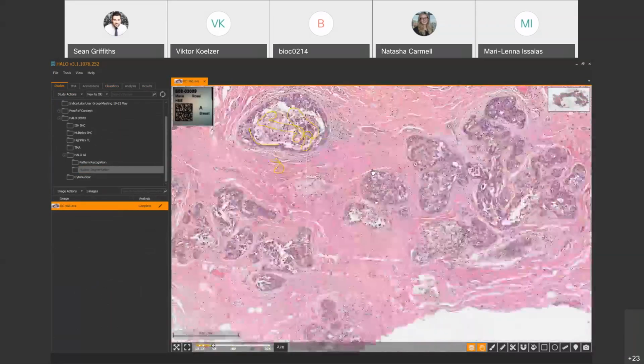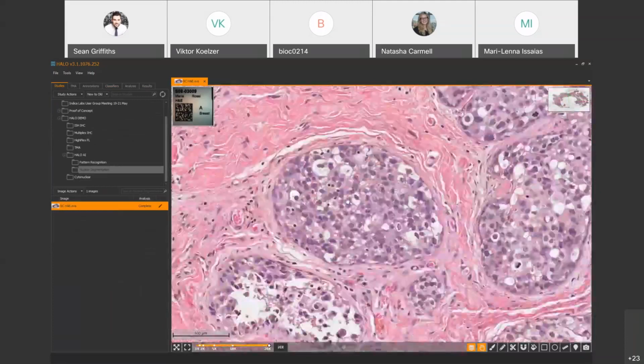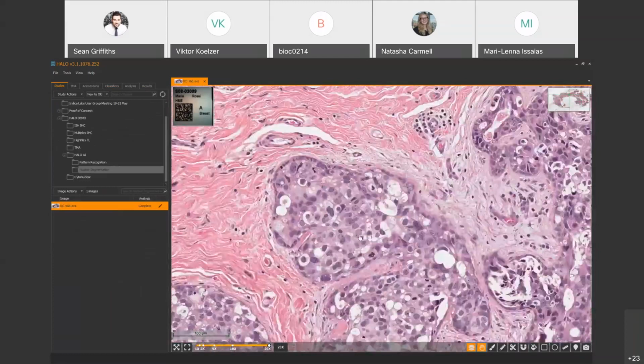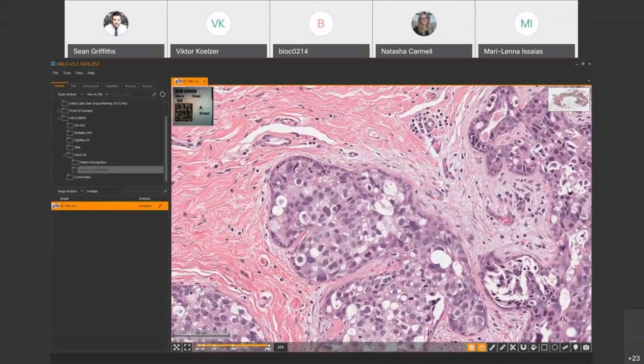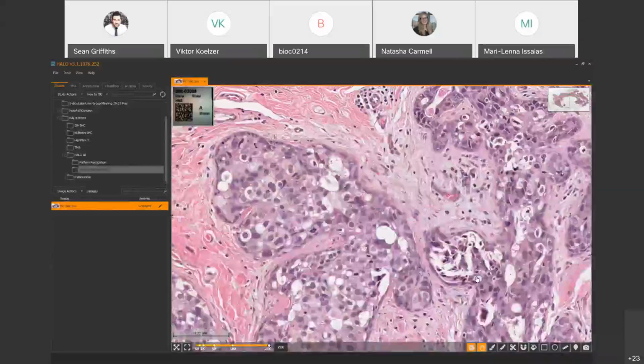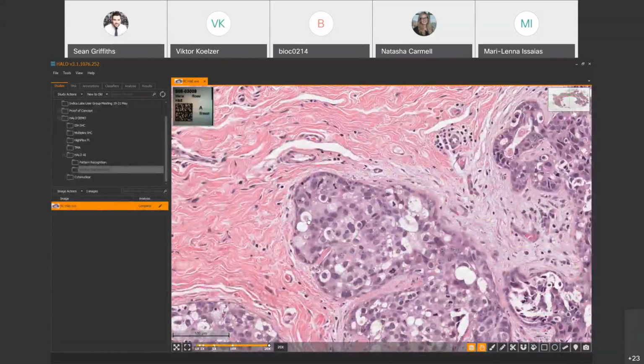where I'm just going to try and use AI to classify the nuclei. So this is an example of a tumor stained with H&E, and you've got stromal cells proliferating, tumor infiltrating lymphocytes and the tumor mass itself. There's an array of image analysis challenges here based on the size of the nuclei and the stain intensity and so on.